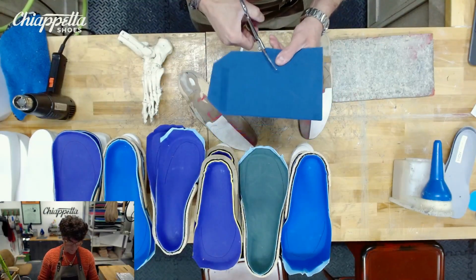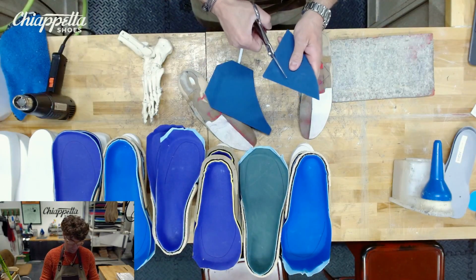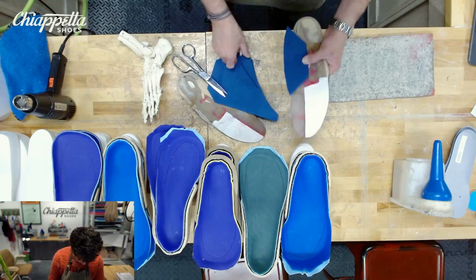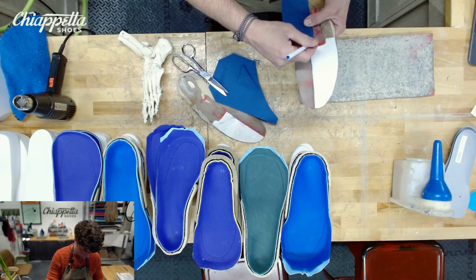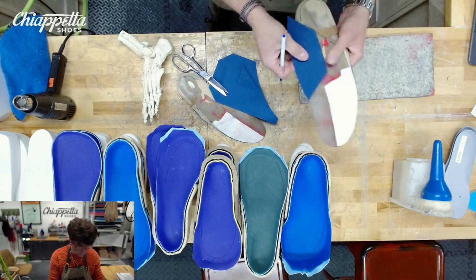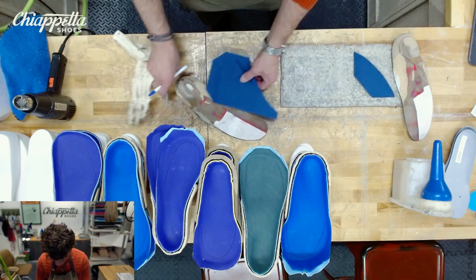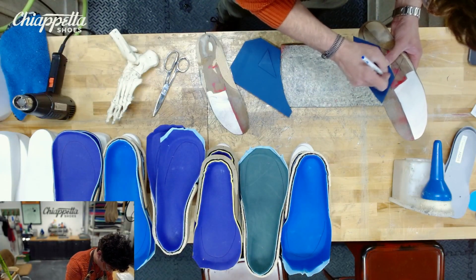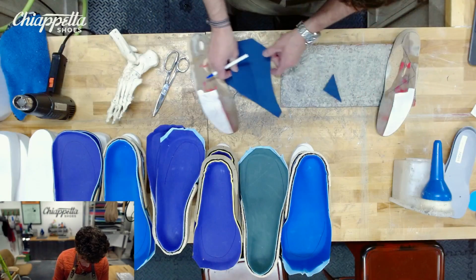So, arts and crafts time with Mr. Chipper. Mark one. We want to wrap that around the side. I don't like just scooping this out. Structurally, it leaves a weakness with the orthotic and it can break down very easily. We don't want to do that. Okay. Cut the same shape for the left side.